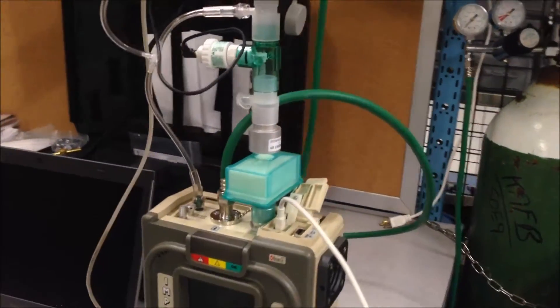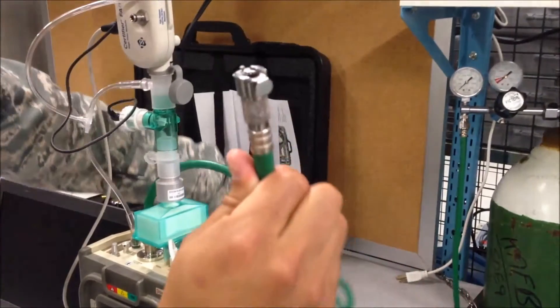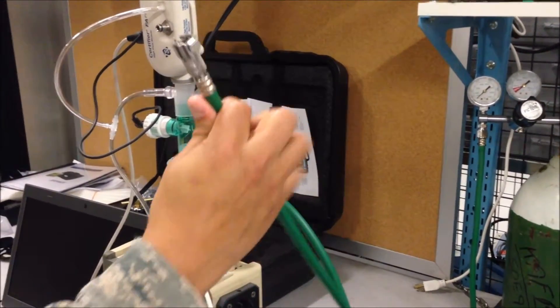Connect the other Y-tubing connector that separates from the hose to the high flow module.